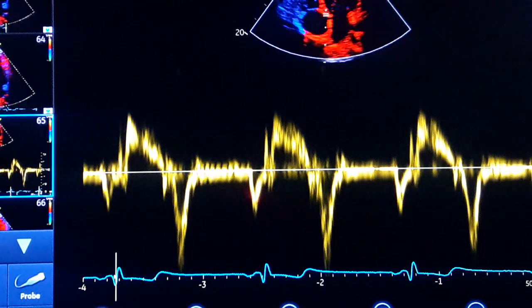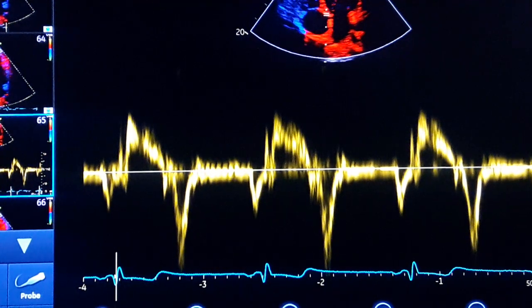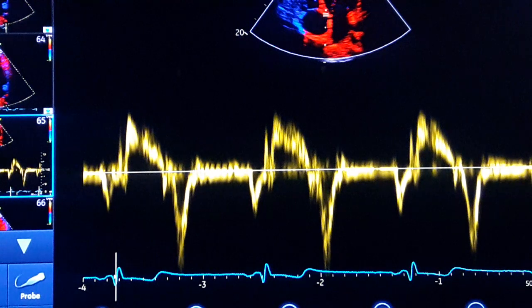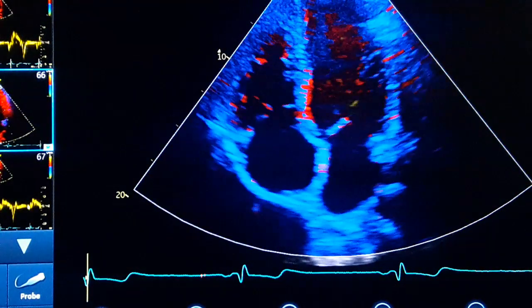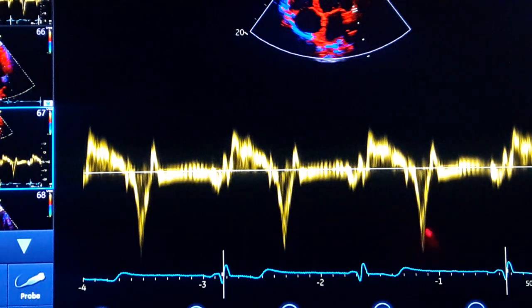This spot and this spot are for A', and this is S', which especially represents — we measure it for right ventricular systolic function. It gives us important findings and parameters for indirectly measuring the systolic function of the right ventricle. When we are done with the medial annulus, we go to the lateral annulus, put the cursor on the lateral almost parallel to the movement of the lateral annulus, and then repeat the measurement of E' on the lateral wall.